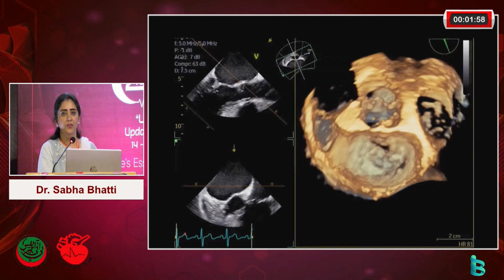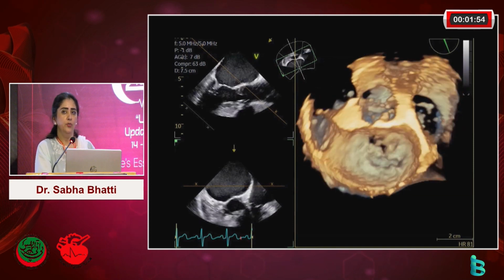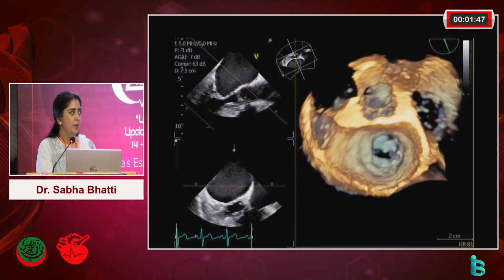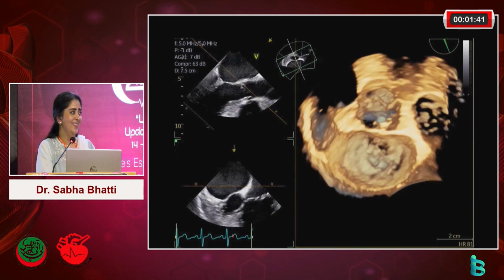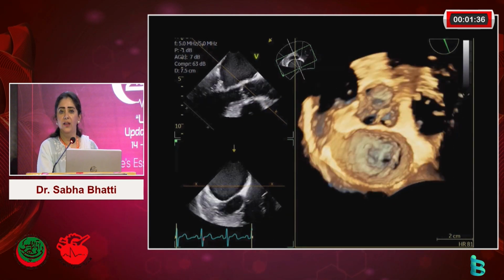So remember, mitral valve area that is commonly used for assessment of severity is going to be your cornerstone in deciding who gets a balloon valvuloplasty or gets referred for surgery. But you have to make sure your measurements are done correctly. And in this day and age, you should make sure that the area is acquired at the tips. Remember, if you cut it here, you're going to measure the wrong valve area on the patient.